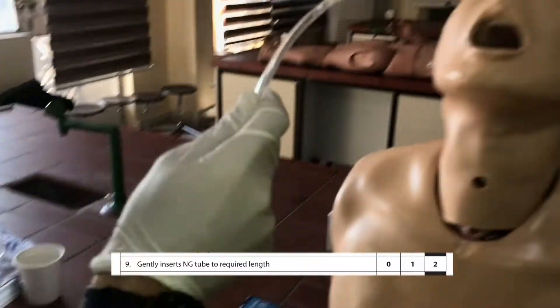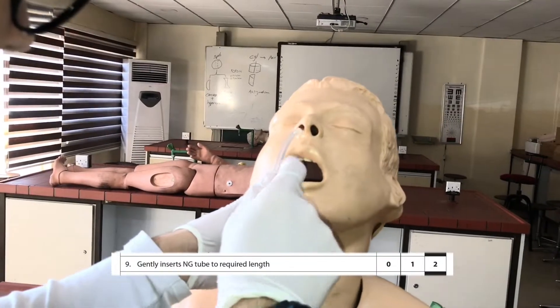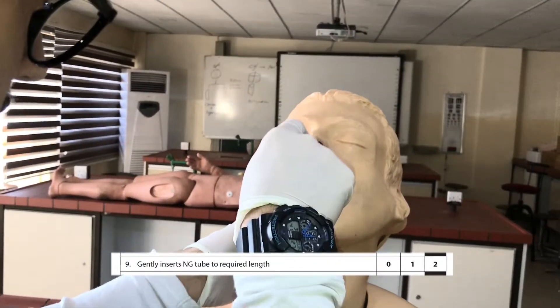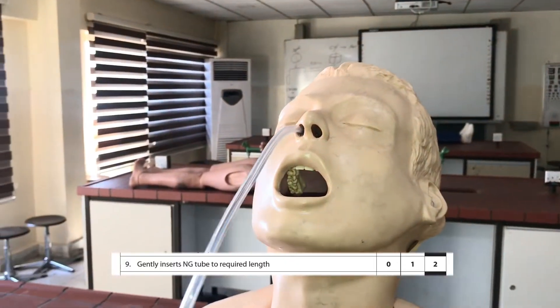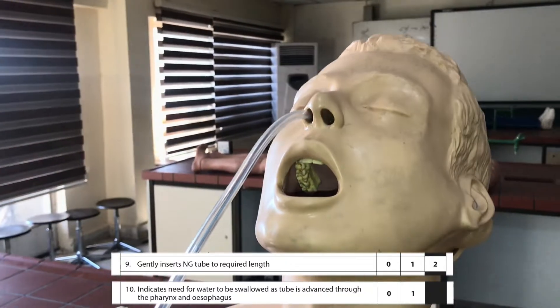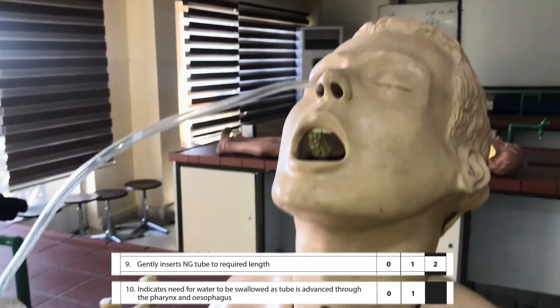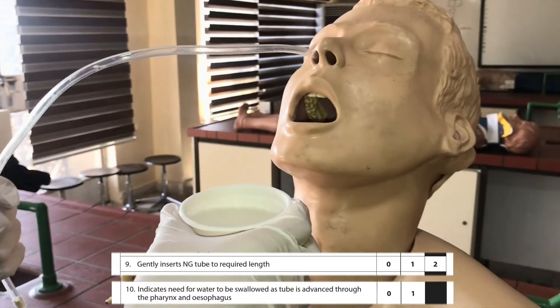Then I gently put the tube into the nose, and I give a glass of water to the patient to be swallowed as the tube is advancing through the pharynx and esophagus.